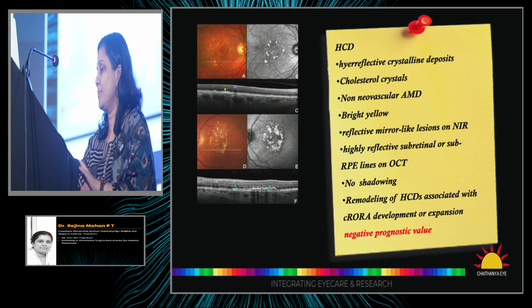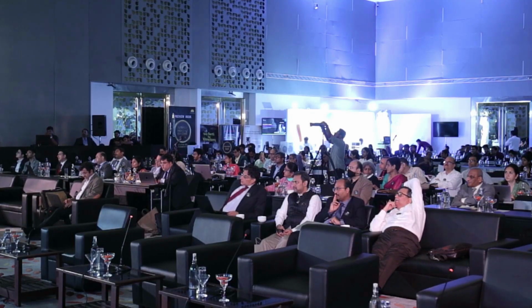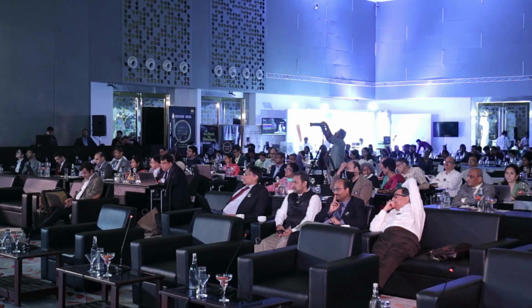Thank you, Dr. Rejina. So if you see something hyperreflective, if it's not a vitelliform, if it's not onion peel, and it's along the Bruch's, just call it HCD and move on with life.